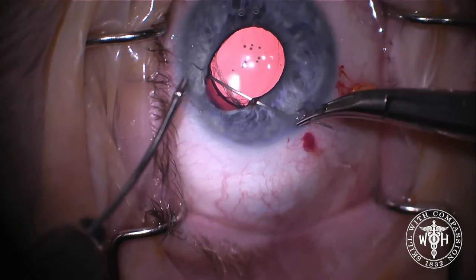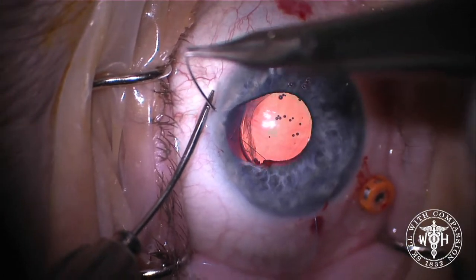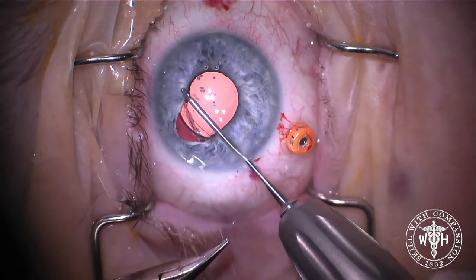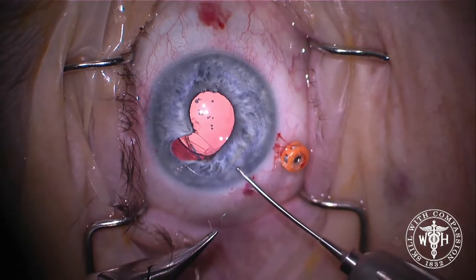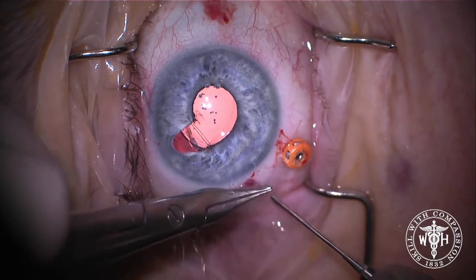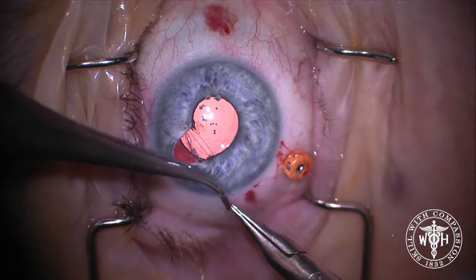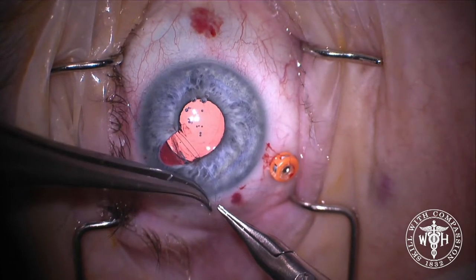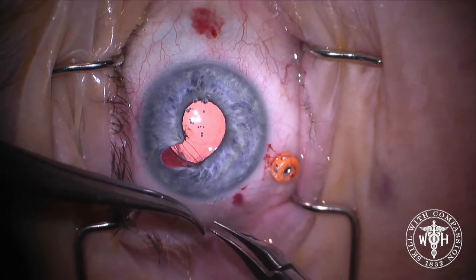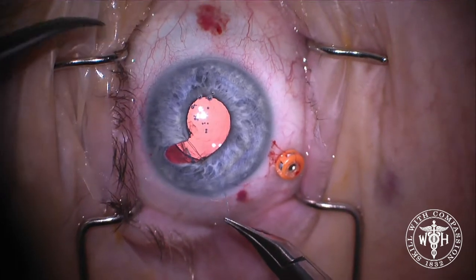So we're going to use a well-described and fairly simple technique of just repairing this pupil border by using a sliding knot — also called the Siepser knot. In particular, this is the Condon-modified Siepser knot. We've just taken a prolene on a CIF-4 needle, placed it through the proximal and distal areas of the iris defect, and now we're tying this sliding knot — basically a 2-1-1 knot to bring that iris defect together.